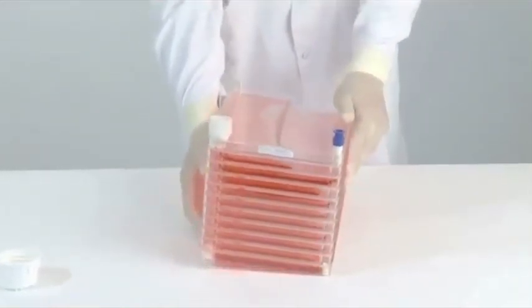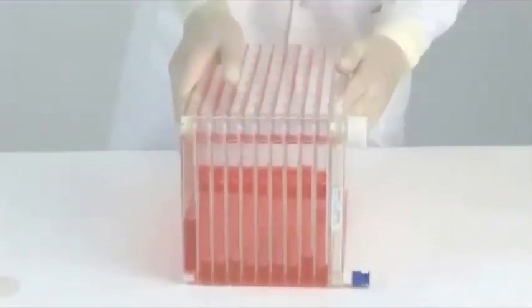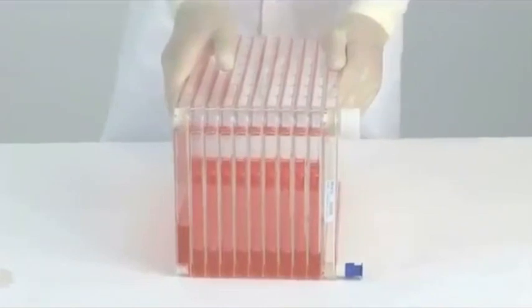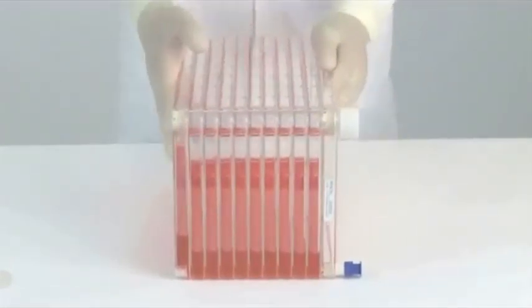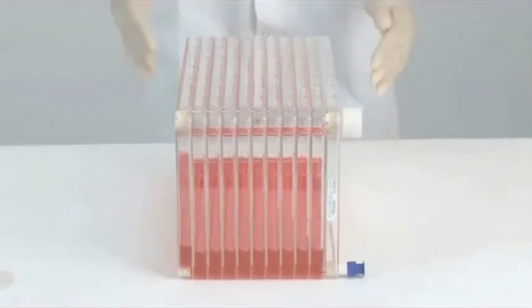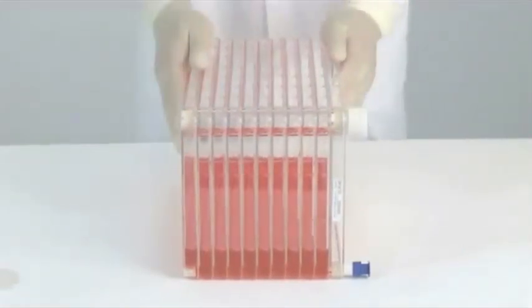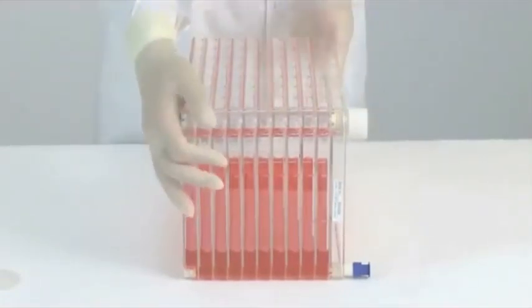Individually wrapped replacement closures are available from your NUNC distributor. To equilibrate the media level in all chambers, place the Cell Factory System on the long side with the small port. The white vent closure port should be at the top. This orientation is important as it will prevent the vent filter from getting wet.